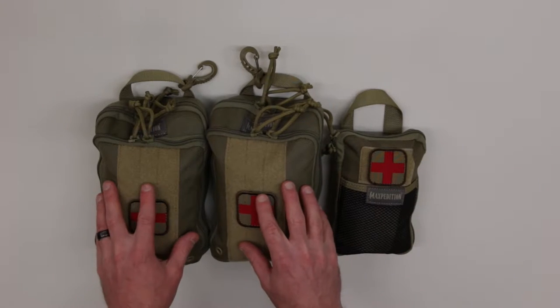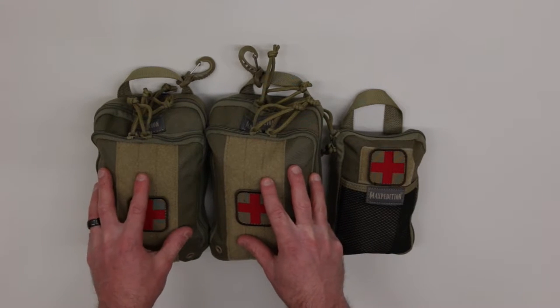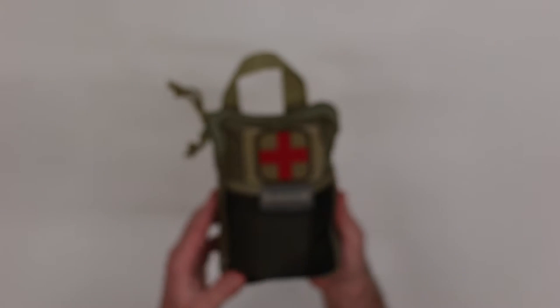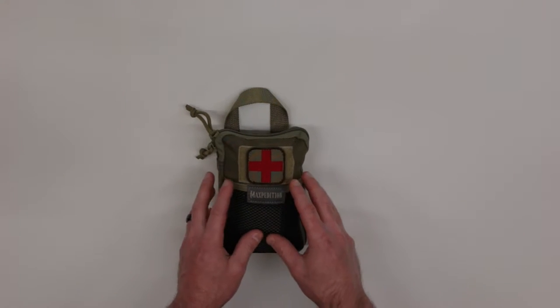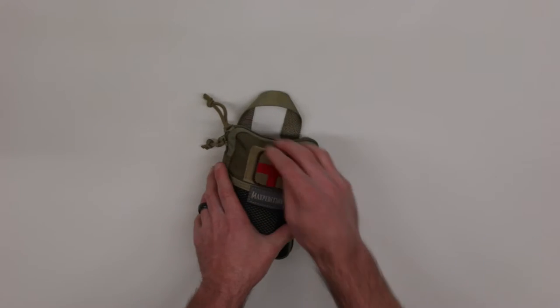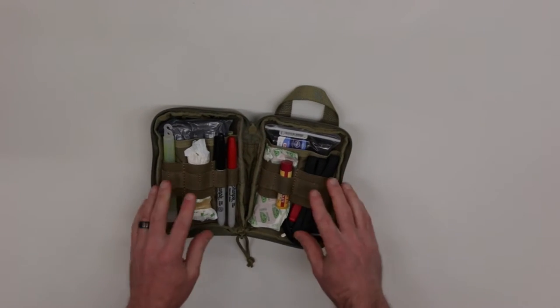Now I want to show you some of the other IFACs I've assembled myself. We just talked about the Maxpedition Extra Large Zip Hook Pocket Organizer — I have two of those. I also have another IFAC assembled using a Maxpedition EDC Pocket Organizer, which is obviously smaller. While I can't carry as much as in the larger organizer, you can still fit a lot of quality contents in a smaller package.